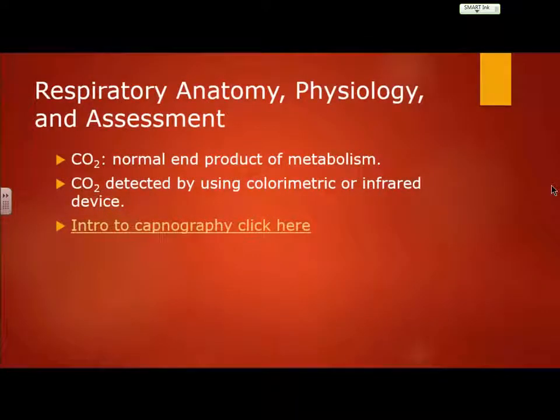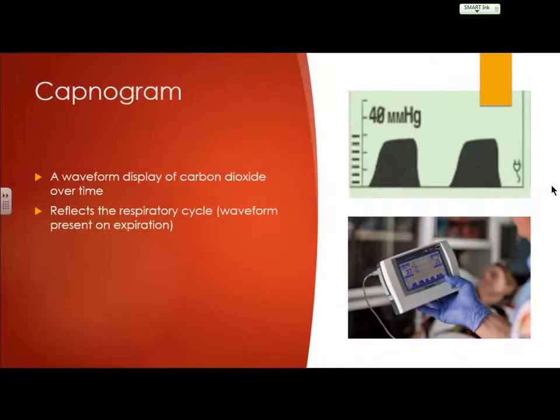I have a question. You said you can tell lengths of expiration by how wide or how... Not with that, but this can give you an indication here. Okay. And then looking at their overall perfusion status and everything else that goes along with that.